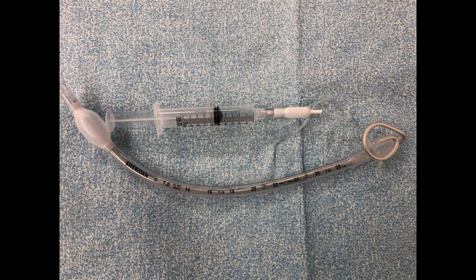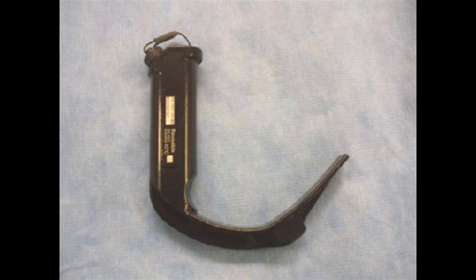In this situation, the use of an endotracheal tube stylet will allow the shape of the tube to be preformed, giving it a tighter curvature, or sometimes perhaps even a hockey stick shape, in order to assist passing the tip of the endotracheal tube through the glottis. Again, while this does happen with conventional laryngoscopy, it is particularly challenging with video laryngoscopy, and either a generic stylet or the specialized GlideScope stylet will be necessary to successfully deliver the endotracheal tube around the corner to the glottic opening.